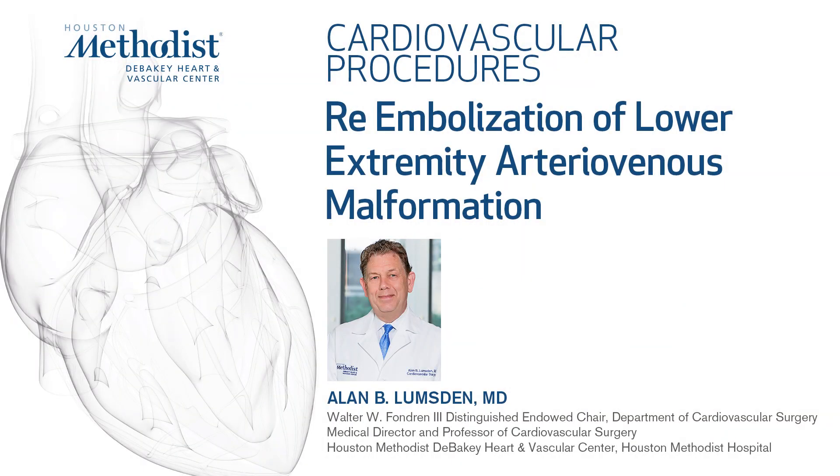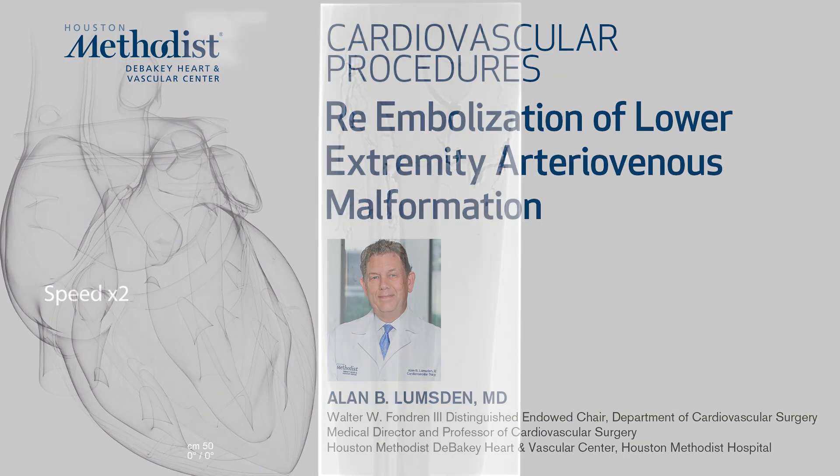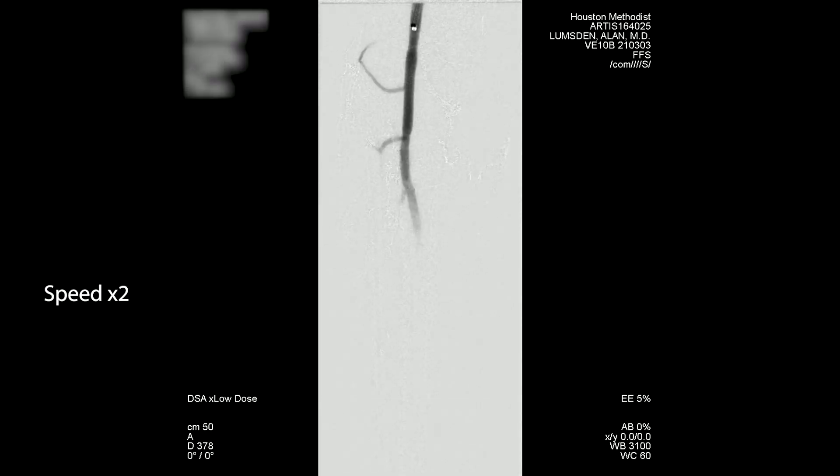This is another example of arteriovenous malformation. This is a patient who had previously been embolized — that's the onyx you can see in the original study. She had a malformation and thinning of the skin with near skin breakdown in her anterior shin. We had previously embolized that, excised it, and put a skin graft on it.